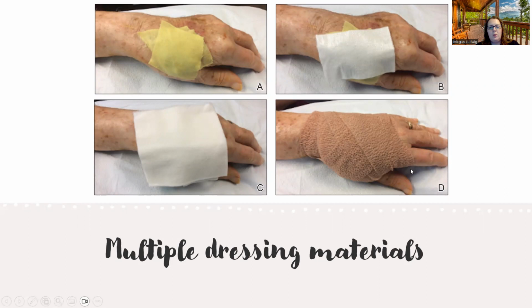You could use this over here in D, which is Coban. So it's kind of self-sticking. Whoever has seen Coban, you could wrap it around for some good compression, but not too tight. And it keeps it in place, but doesn't stick to the skin. It sticks to just the dressing. So that's pretty handy. That's Coban.